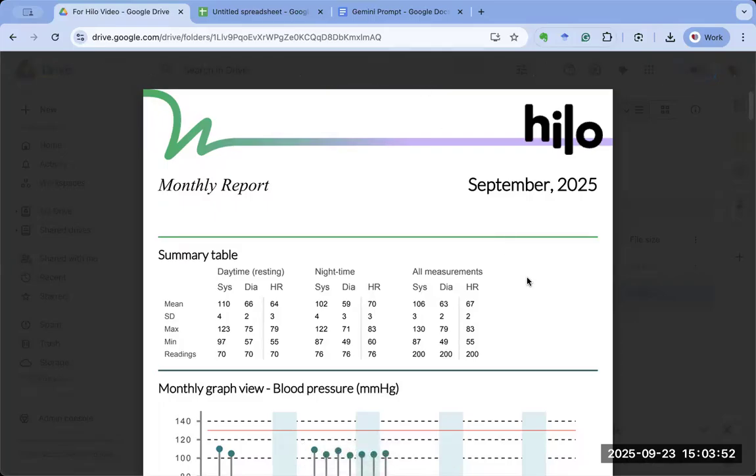Hello, everybody. I thought I should record a video on how to look at your Hilo blood pressure device data. I'm Dr. Shabnam Das Kar. I'm a functional medicine doctor with a special interest in blood pressure, better blood pressure management.